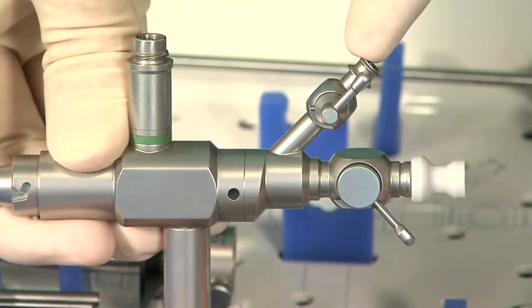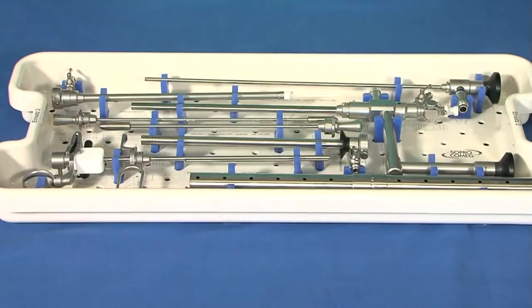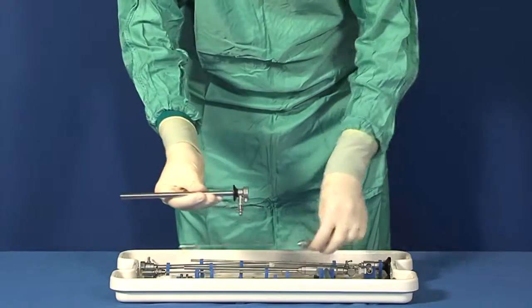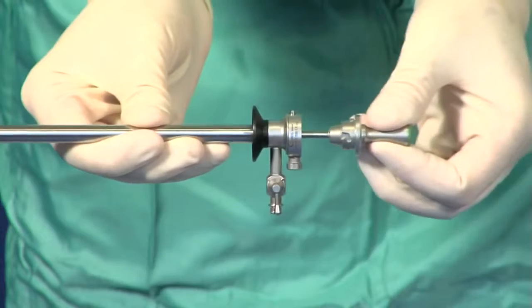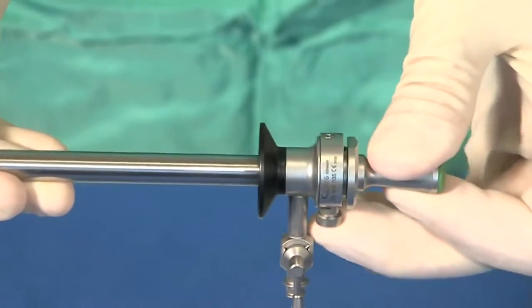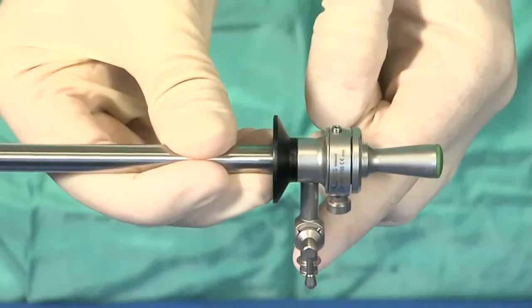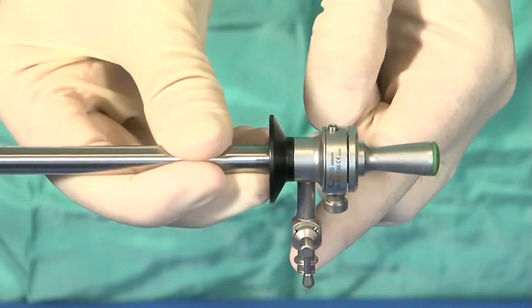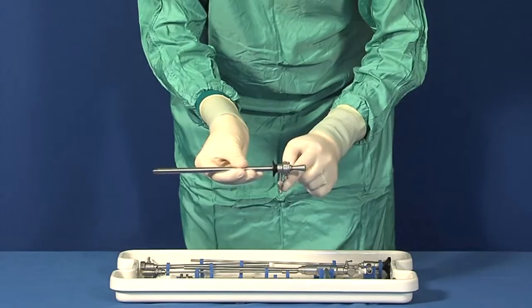A luer fitting is used for connecting the device to an irrigation system. The 27 French outer sleeve comes with its own obturator. However, a conventional dilation system is required in order to insert it into the cervix. The luer sleeve fitting can be used to connect to a suction system, thus affording the option of creating a continuous flow in order to distend the uterine cavity during the procedure.